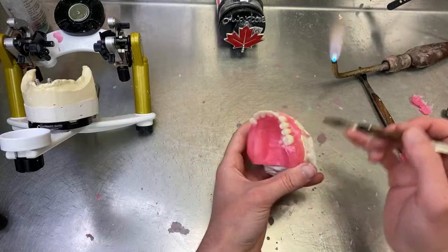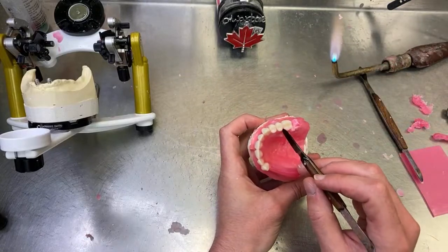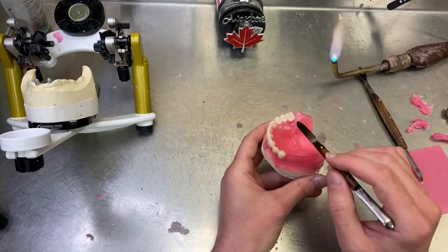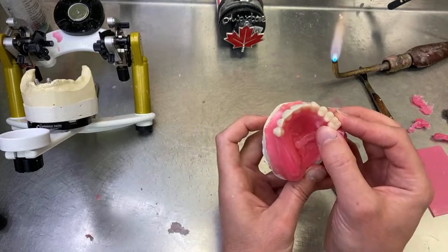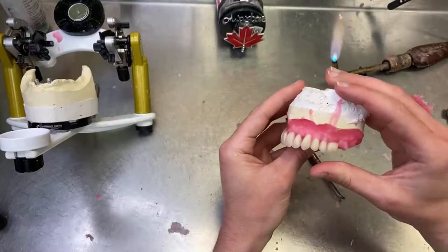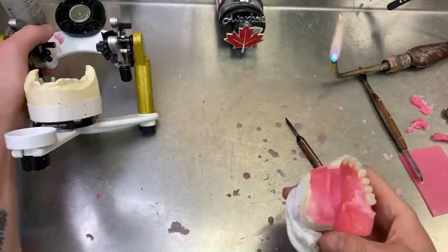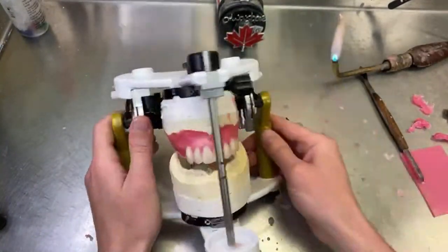Okay, so what I'm doing here is, I told you, after you set the first tooth where it is exactly, then you know how to follow with these teeth here. What I'm doing is making sure they're all in a straight line. I make sure from this way all the cusps are on the same line, and when you put it back on, it's guaranteed it's going to be good.